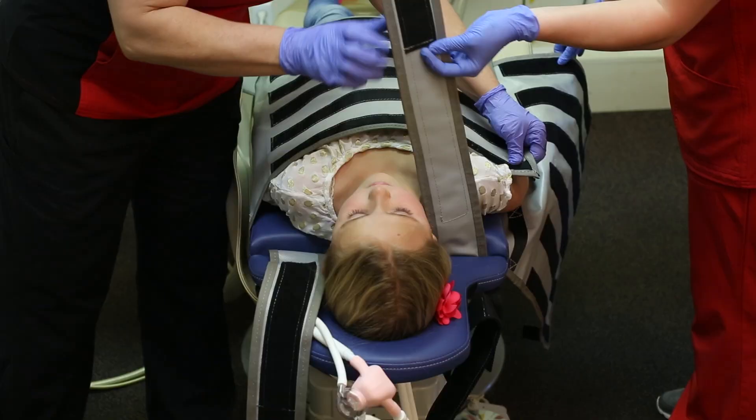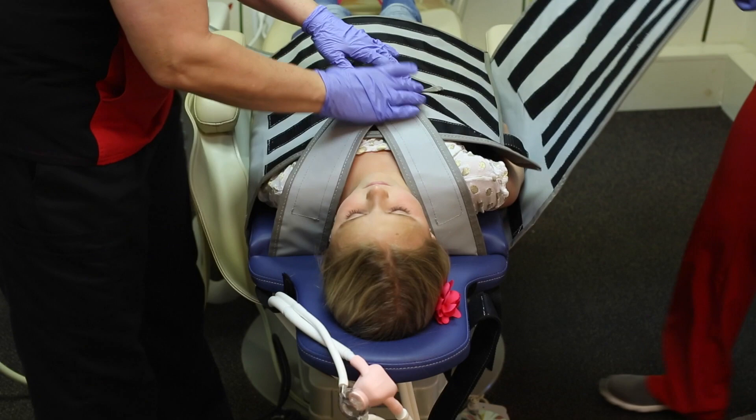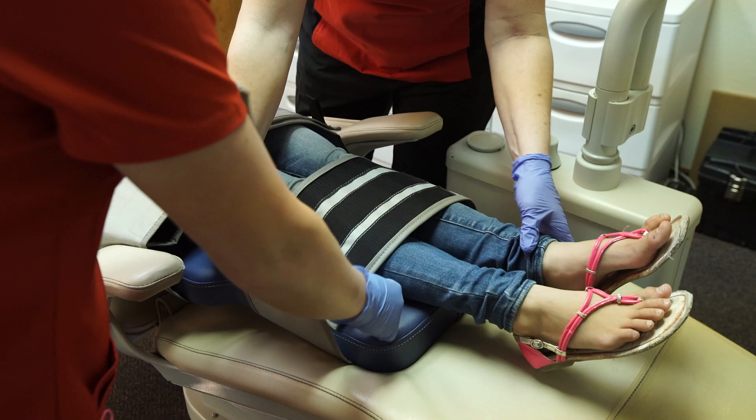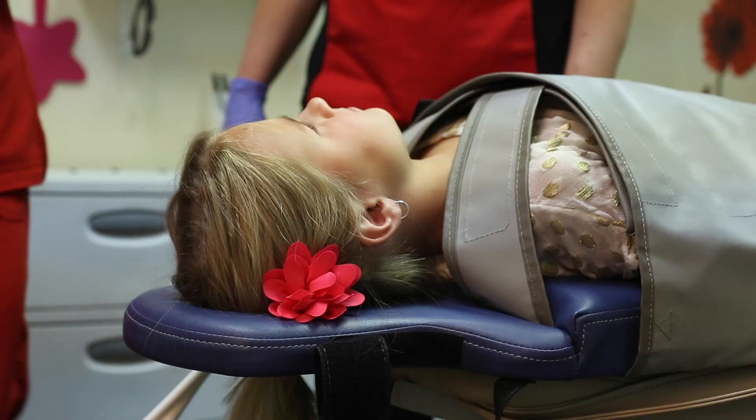Place the torso wrap with the velcro facing up. Fasten the shoulder strap in a V formation. Now place the top torso wrap over the shoulder straps. Secure the leg wrap in the same fashion as the torso wrap.